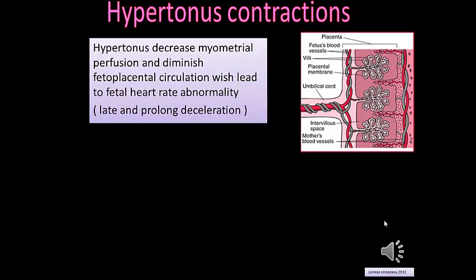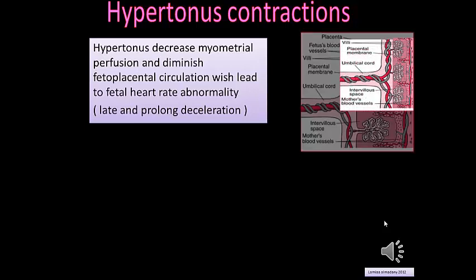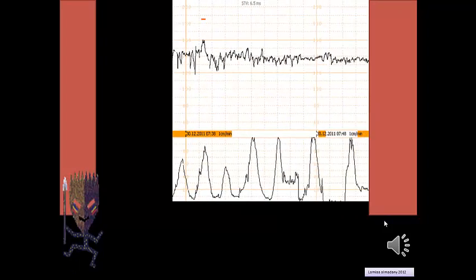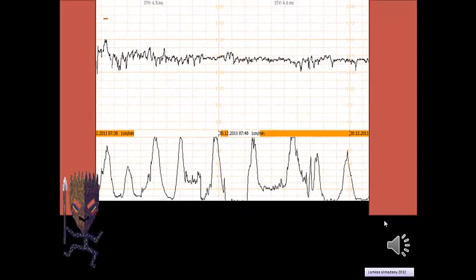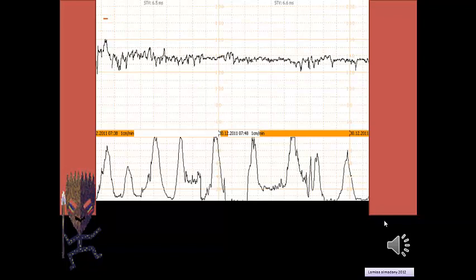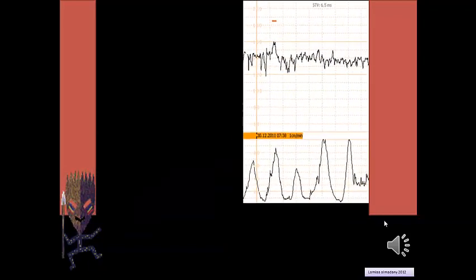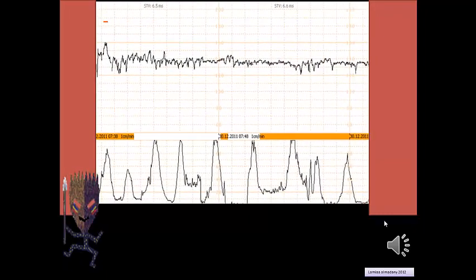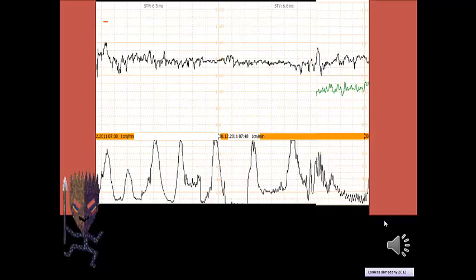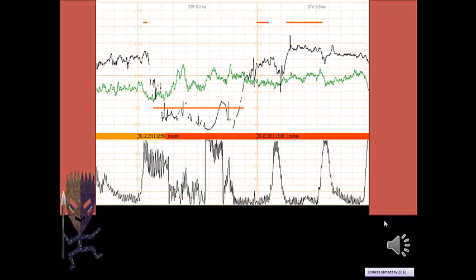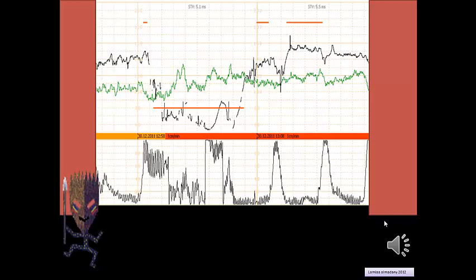During hypertonic contractions, persistent uterine contractions lead to decreased myometrial perfusion and diminished fetal-placental circulation, causing fetal heart rate abnormalities and late and prolonged decelerations. Looking at the CTG from the beginning, we can identify 1, 2, 3, 4, 5 contractions within 10 minutes — the fetal heart rate is normal at 140 beats per minute with good beat-to-beat variability. But when the patient begins having hyperstimulation contractions, a period of bradycardia followed by variable decelerations appears.